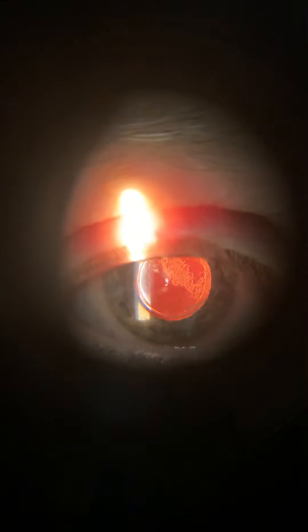So now we've dilated your pupil, we can see the red reflex of your retina at the back. We can see at the very edges of your pupil that we've opened up where that intraocular implant has gone in. And then we can see in the sort of central upper quadrant.